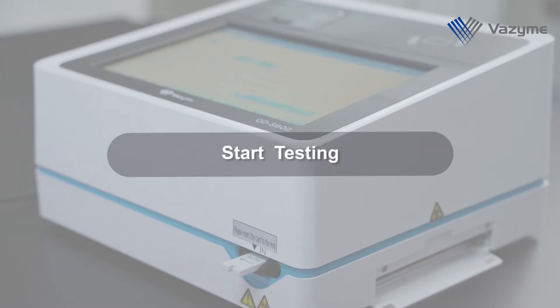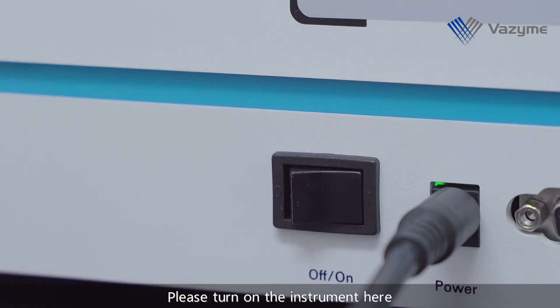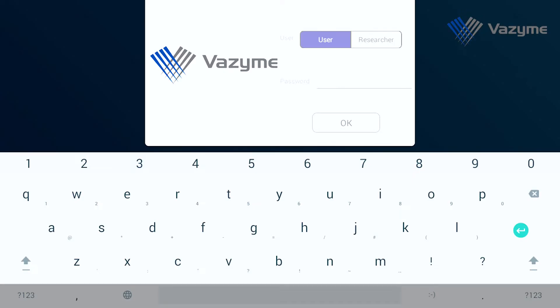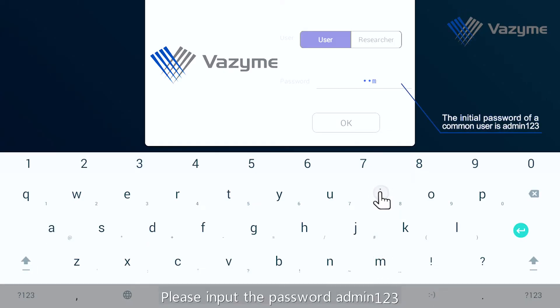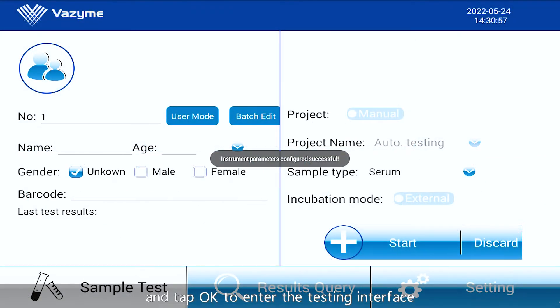Start testing. Please turn on the instrument. Once the instrument completes the self-testing, please input the password admin123 and tap OK to enter the testing interface.